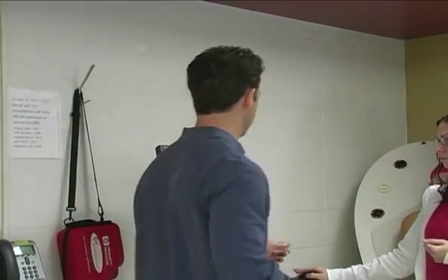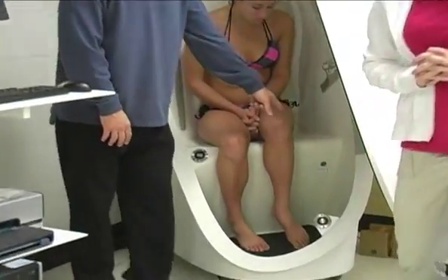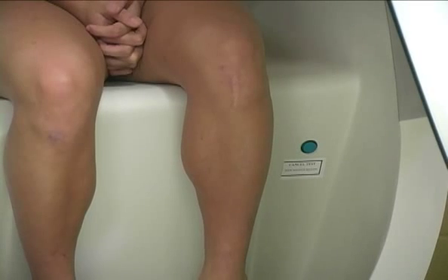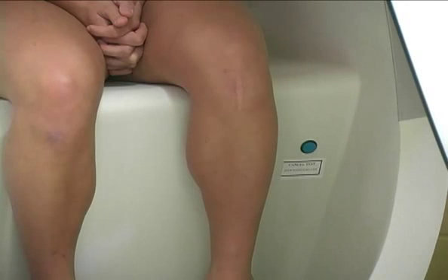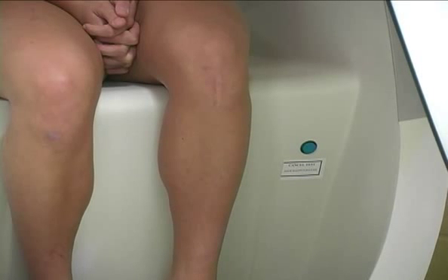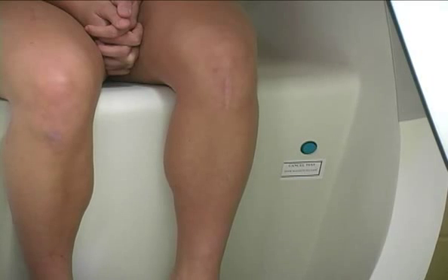One other thing I want to point out before you continue is behind her left knee is a blue button. That illuminates, lights up when the BOD pod is engaged, when the magnets are engaged, about 5 seconds after the door is shut. Why I point that out is you can't get caught in the BOD pod. If somebody did have an issue, again, claustrophobia, most common question, but I've done thousands of tests. I've never had to cancel a test because of the way that's designed, and she's not in there long. But you could if you wanted to get out.